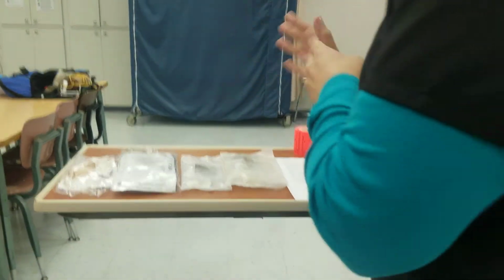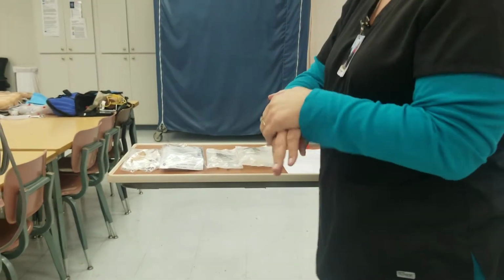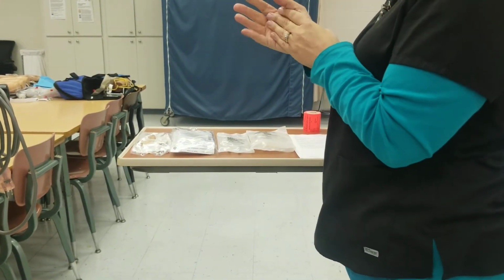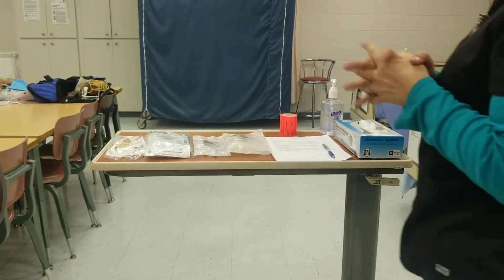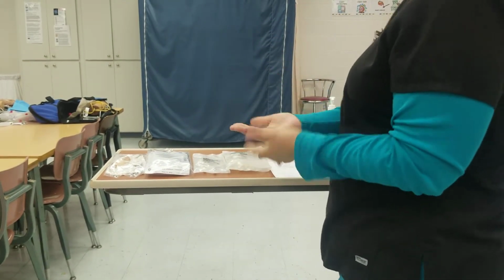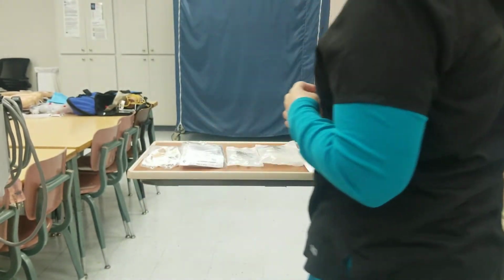So the first thing I'm going to do is hand hygiene. Whenever you do checkoffs, it's not going to be a formal checkoff, but we are going to go pump by pump, making sure that you understand how to do it and you're able to do it. So we want to see you perform your hand hygiene, know your ABCDEs. You would take that order, you identify your patient, name, date of birth, ask them about allergies, okay?